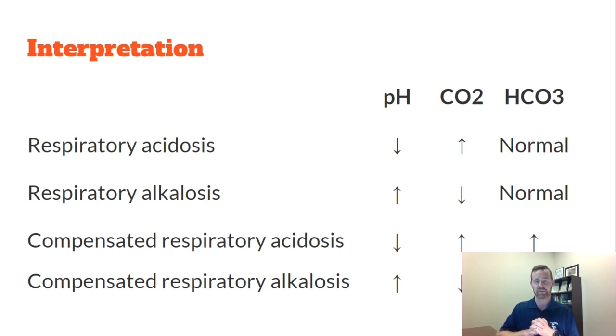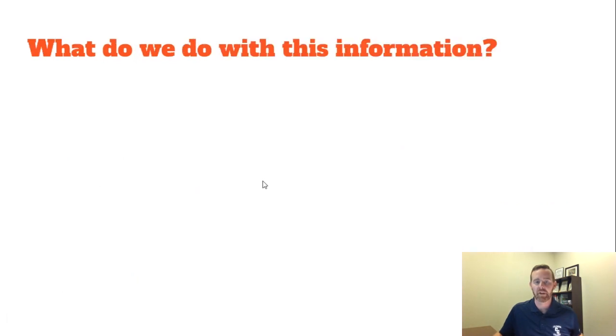Because the respiratory system is trying to compensate. So if you see arrows, essentially, pH and CO2 moving in opposite directions, RO, then you've got a respiratory disorder. If you see metabolic equal for the ME in ROME, if you see them moving the same direction, for instance, both going down, then you've got a metabolic disorder with the CO2 trying to compensate for that problem.